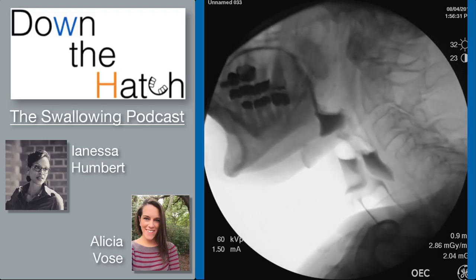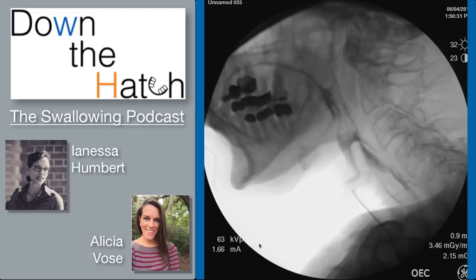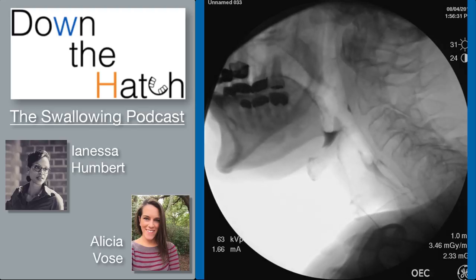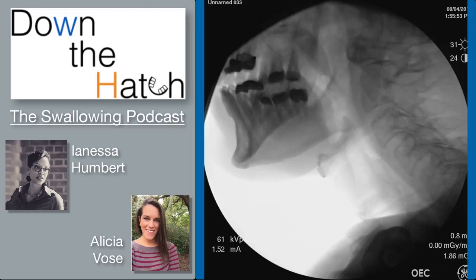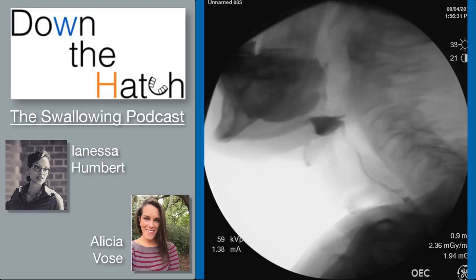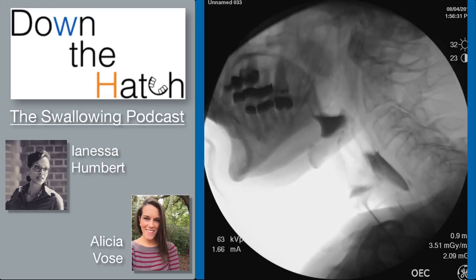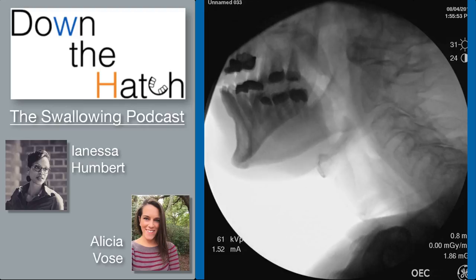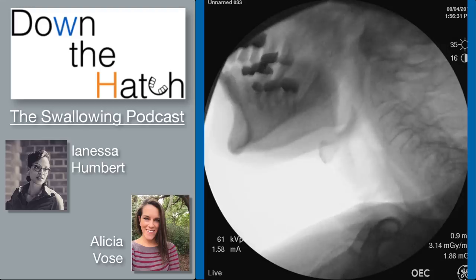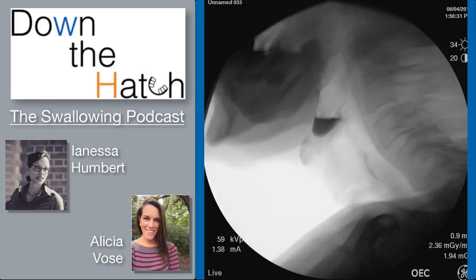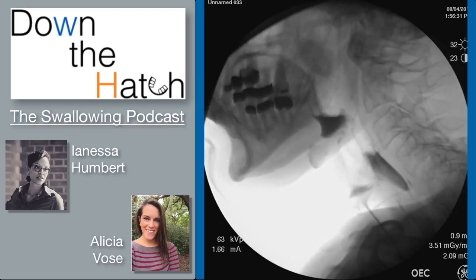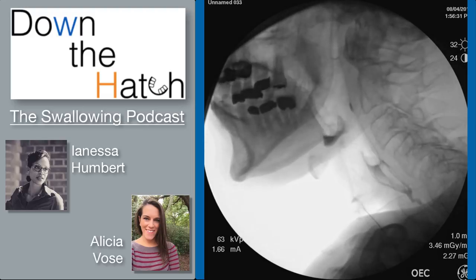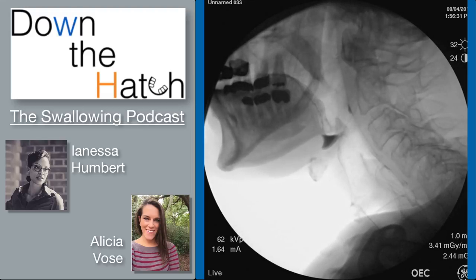This person certainly has issues with laryngeal vestibule closure. Let's go down the list of all the possible events. Do we see lingual control issues? In healthy people with thin liquid, I never see them pour directly into the vallecula quite that much. The tongue wasn't even trying to contain it in the oral cavity — so yes to lingual control issues. You'd have to try cognitively to cause yourself to prematurely spill that much. What about delay?